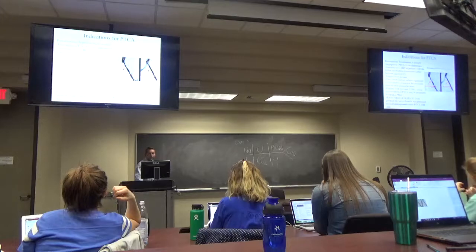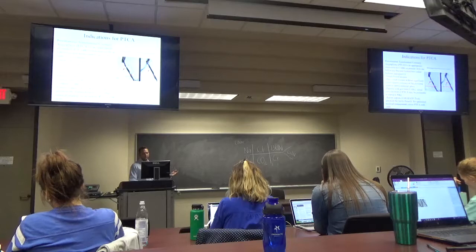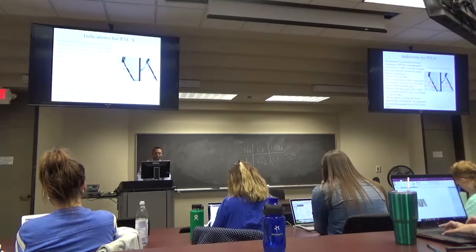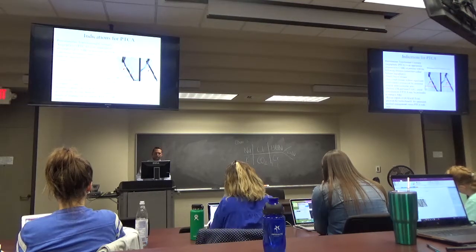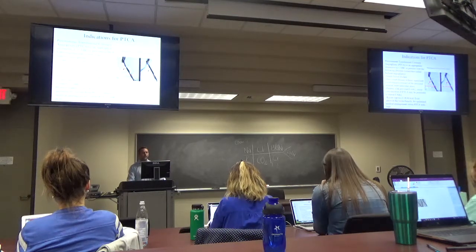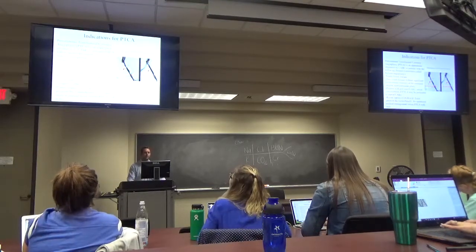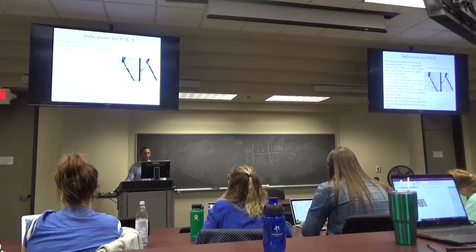So, indications for percutaneous transluminal coronary angioplasty, which is basically stenting. The cardiologist has a high suspicion that you have a significant stenosis through all these things that we've been talking about earlier. This is the time that they pass, in this picture you can see they pass a wire, just a guide wire, past this stenosis, right?